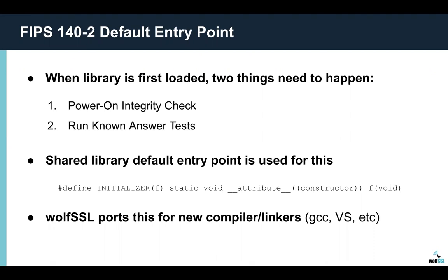These are done automatically by default using a default entry point. So here you can see that we're using the constructor attribute by default for GCC. And then we port this to various compilers and environments as needed.